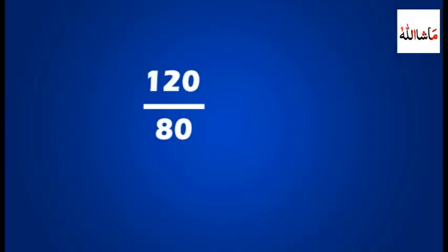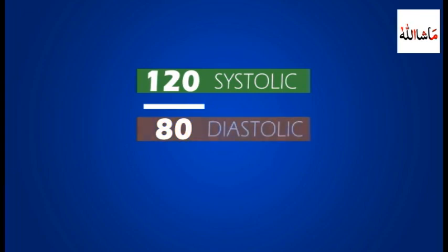If you ever had your blood pressure taken, you likely noticed that the results were stated as one number over the other number, such as 120/80. The number on top, in this case 120, represents systolic pressure, and the bottom number, in this case 80, represents the diastolic pressure. Let's take a close look at the dial used for determining such a measurement.